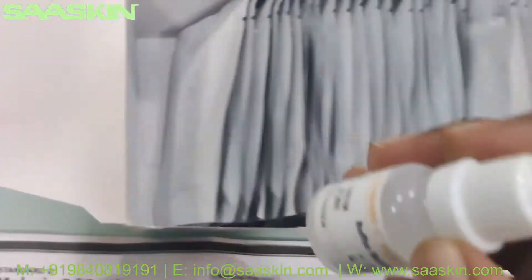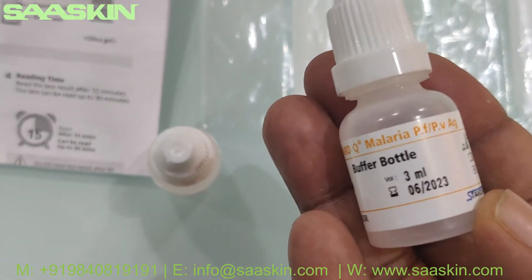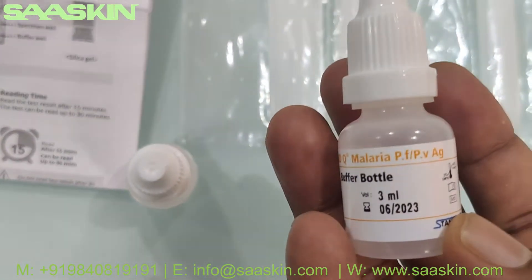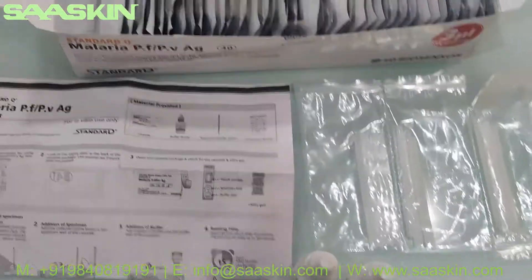There is one more bottle here. Both bottles have the same expiry of June 2023, and are 3ml each. Basically this is a two-year expiry product.